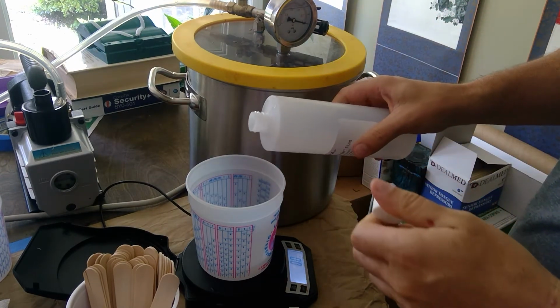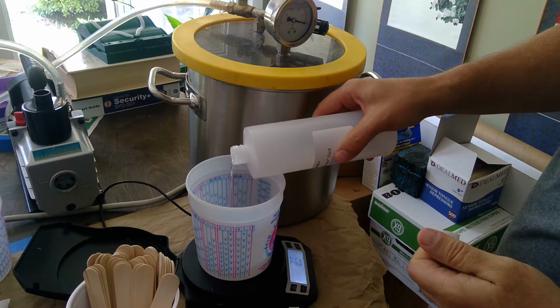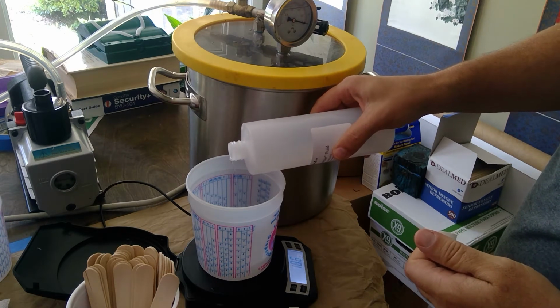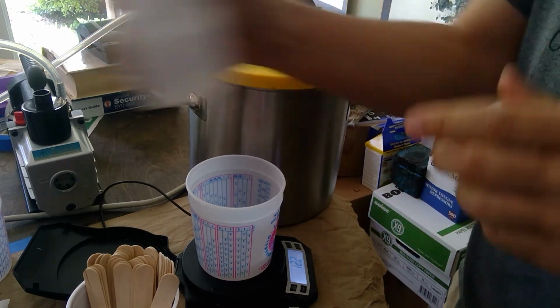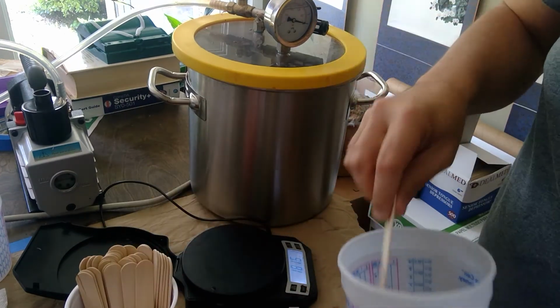We go ahead and put that back to 0 and add 12 grams of the Wonder Fluid for thinner. There we go, 12 grams on the nose. I've been doing this for a while. Now take that off, stir it up. So you're just stirring through, and this ends up creating a lot of bubbles, which is why we have to go through the vacuum process.